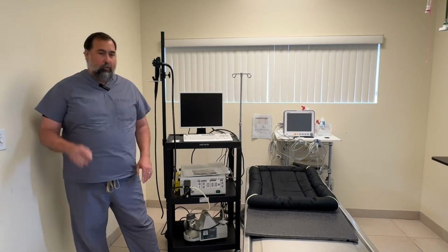Multiple cases. I think one of the times we use it most would be if dogs have swallowed something, a foreign object, and it is lodged in their stomach, and we can see that on other imaging modalities like X-rays. We see that object there, and it is something that we think we can grab with an endoscope. The scope allows us to put pinchers or baskets down and grab those objects. So sometimes we can go in endoscopically and actually get foreign objects out of stomachs without requiring surgery. That's obviously less invasive for your pet, obviously better. So that would be the first obvious thing we use it for.